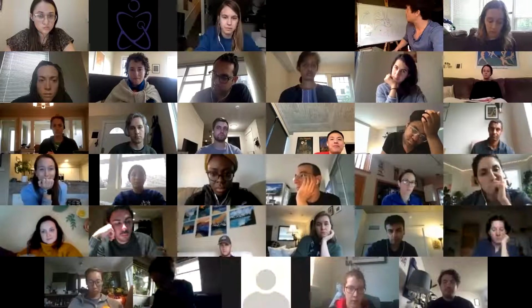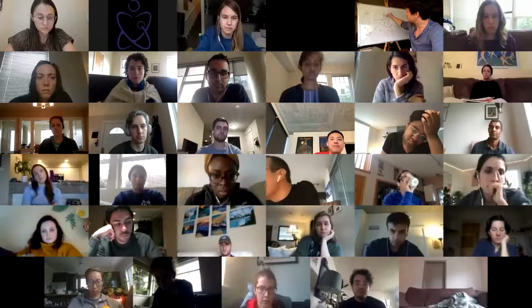Another important point to look at is here, on this side, it's called the paratracheal line, and it should be about 4 millimeters or less.